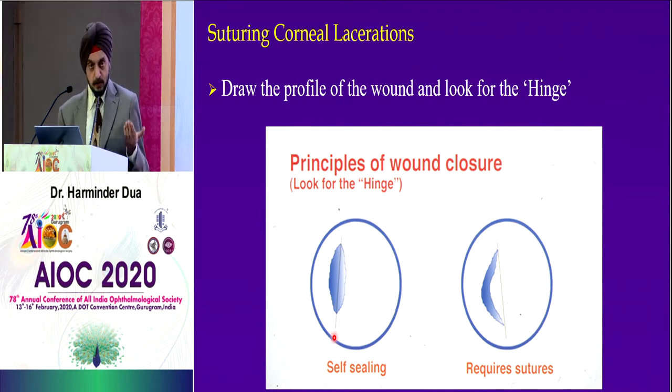If that hinge is within your drawing, it is a self-sealing wound. You don't have to suture it. If that line is outside the area of the wound that you have drawn, like you see here, it is going to leak and you need to put sutures.